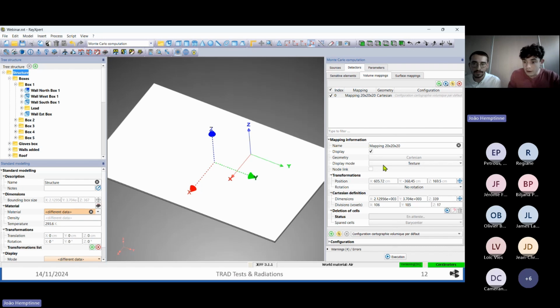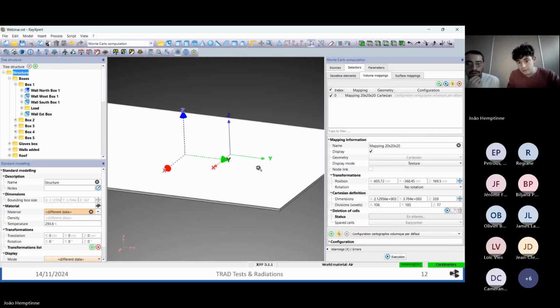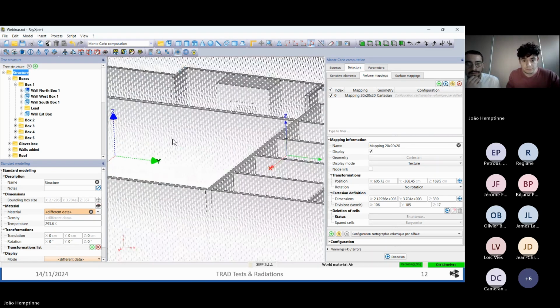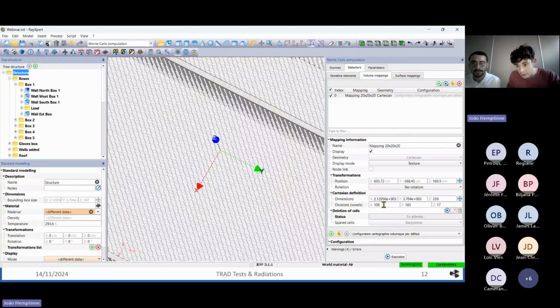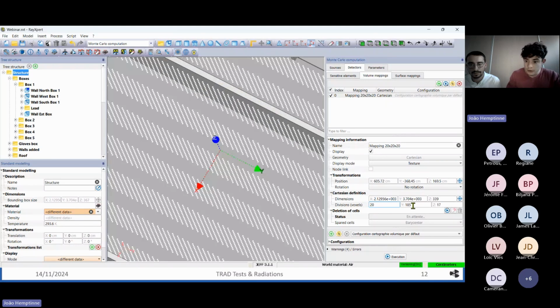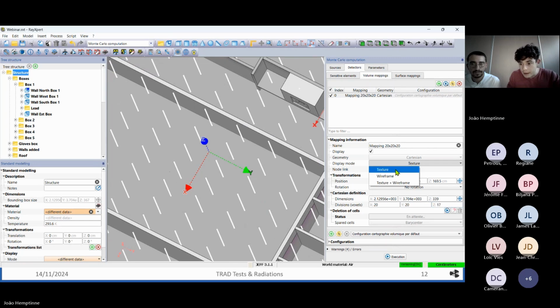So here is the center of the 3D mapping. Okay, so the position here is the center of the Cartesian mapping. Cartesian is a rectangular mapping, basically. You can see more details right there. Maybe I'm going to lower the resolution. We are going to see this just after. Don't worry.